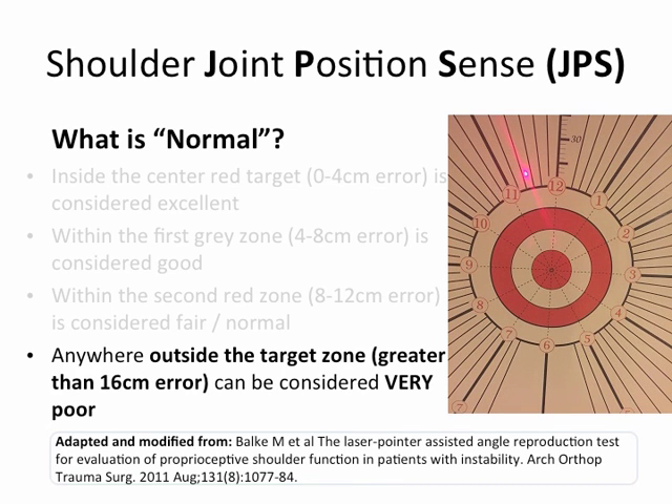However, if they're anywhere outside the target zone — greater than 16 centimeters of error — that can be considered very poor. This can be seen in individuals after shoulder dislocations, shoulder surgeries, or persistent shoulder pain.